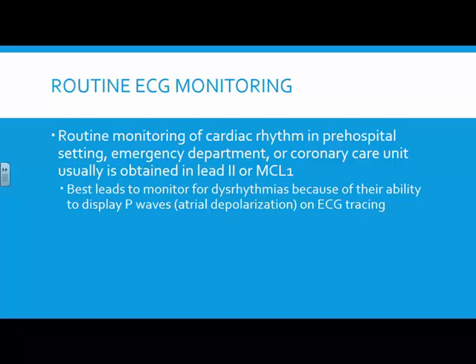So routine monitoring is going to be in lead 2. Why is it in lead 2? It shows the main flow of electricity through the heart.